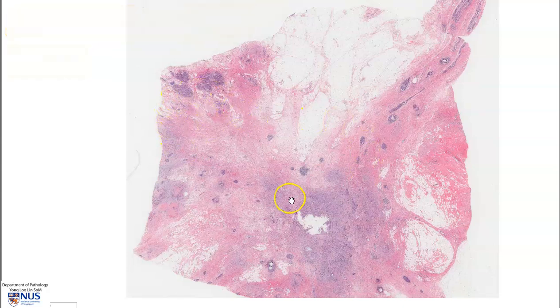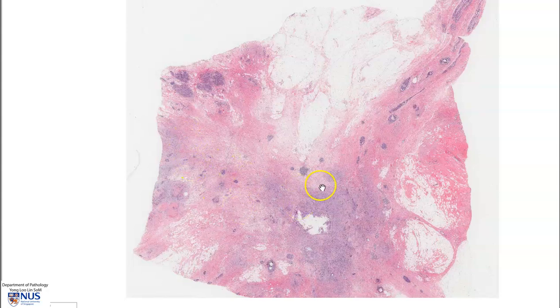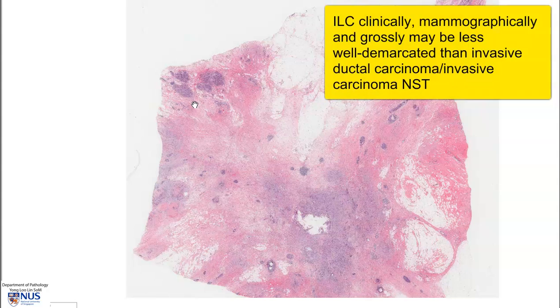On this low power view, we can see that it is not as well circumscribed or well defined as invasive carcinoma NST, no special type, or invasive ductal carcinoma. This kind of has a more subtle appearance and is a bit more difficult to make out the outline of the invasive tumor. Hence, the clinical presentation is usually not that of a very well defined hard mass. It presents more of an area of thickening or induration, and sometimes it is also not so well defined in mammographic images.